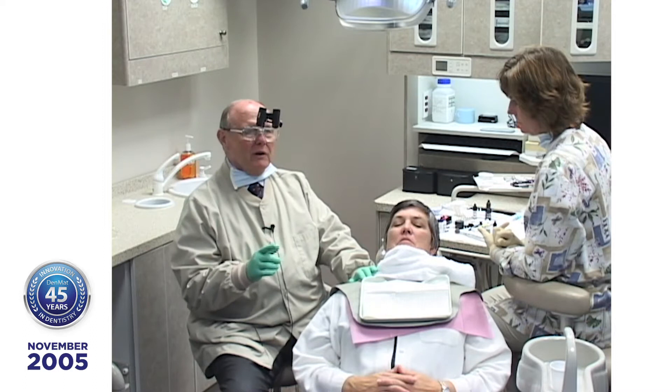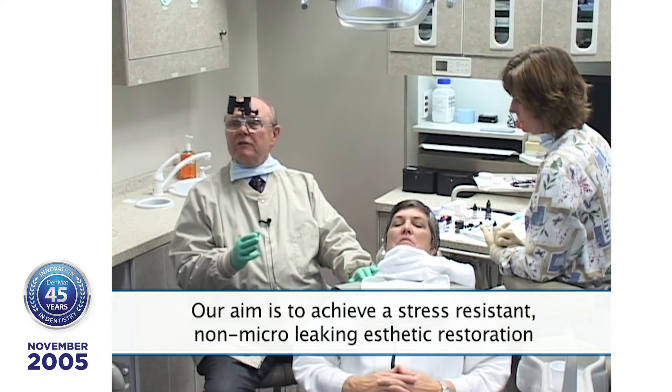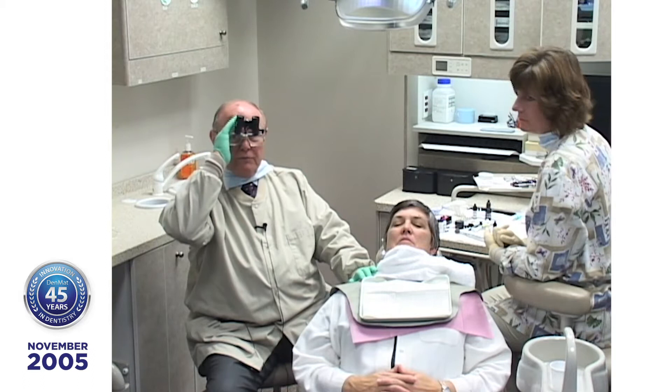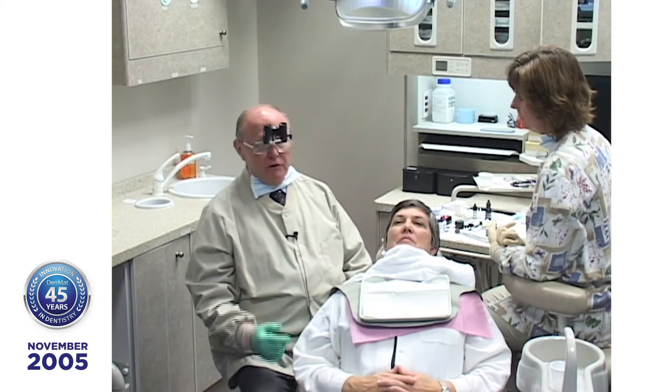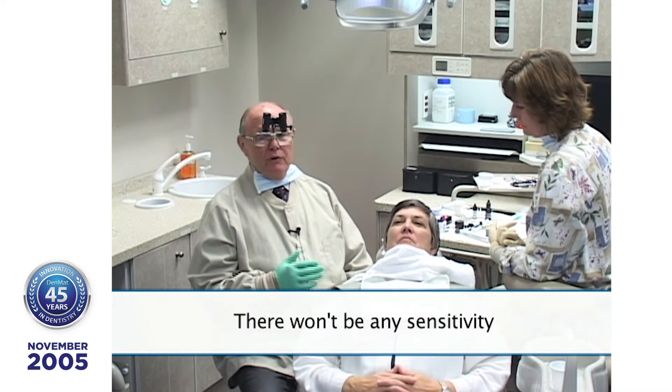Something important: you've got to have magnification. Four power is the key. If you don't have four power, you're being underserved. When I put these in there's very little bleeding, if any, and there won't be any sensitivity. The reason I can do that is because I can see so well — I can distinguish between sensitive tooth structure visually rather than by tactile sense.